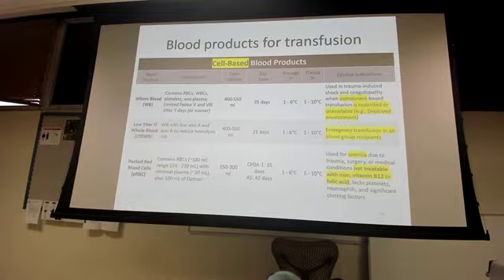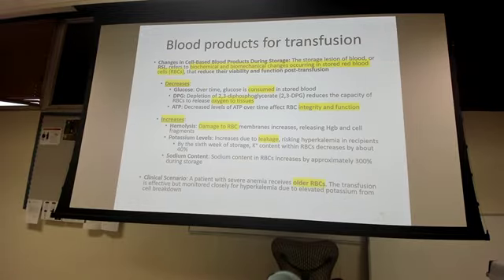And then we have packed RBCs. Remember I said there'll be about 2 left in the ED for you. If you do have an emergency that comes in, and you can't get to the lab quickly, you can utilize those for your patients that come in. Those red blood cells are coated with what's called CPDA or AS. This just preserves them so that they can last a little longer. If it's coated with CPDA, they're good for about 35 days. If it's coated with AS, it's good for 42 days. And they're used for anemia, trauma, surgery, or some other medical conditions. Don't worry about that.